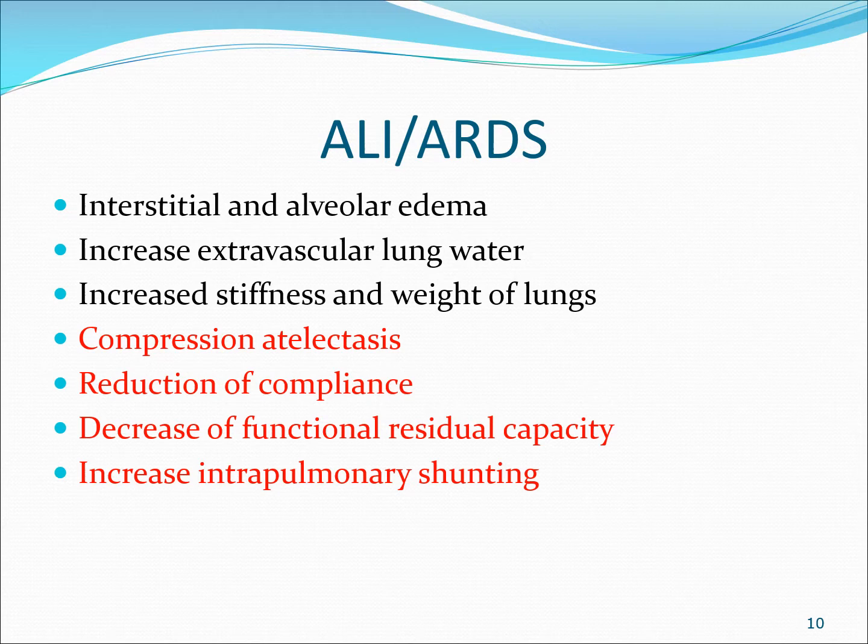So compression atelectasis, reduction in compliance, decrease in functional residual capacity, all of these things make the patient really, really sick. Because of the compression atelectasis, this is a lot of times when we prone patients. When we prone patients, we make gravity work for us in the other direction, but we're not necessarily talking about proning, we're going to talk about APRV.